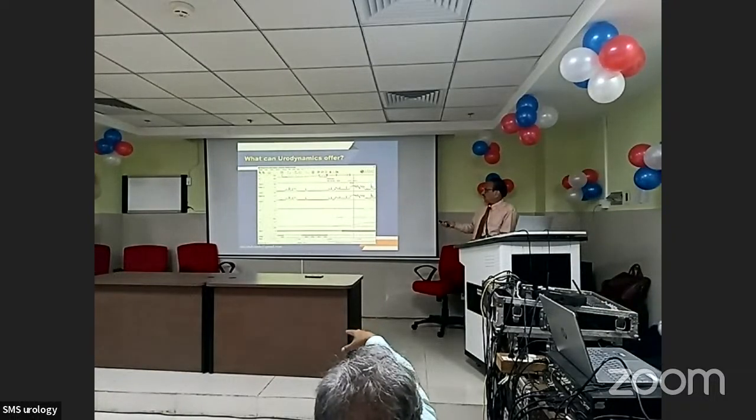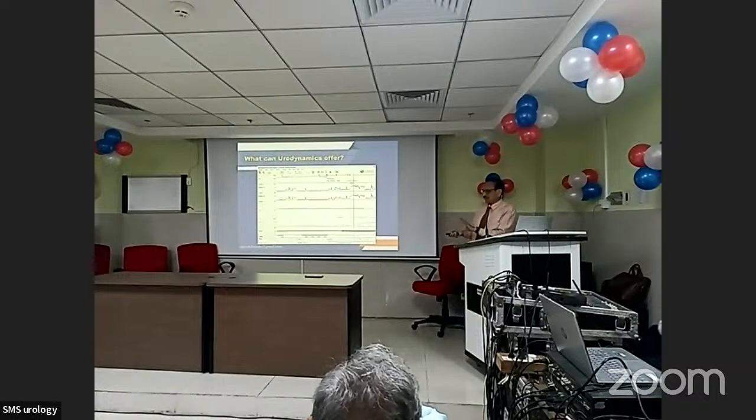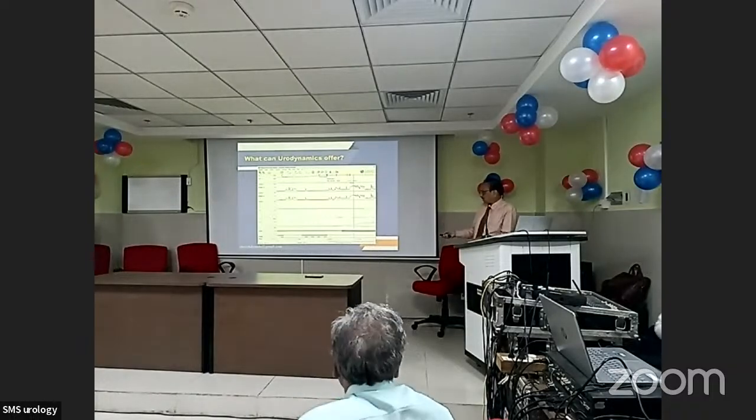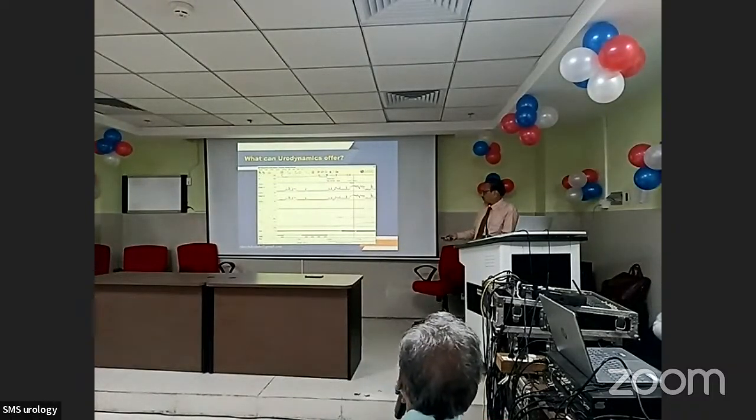Yeah, she can do that to avoid it. So I mean, you must understand it. The patients are asked to strain, and the images show a very high pressure because of the strain.